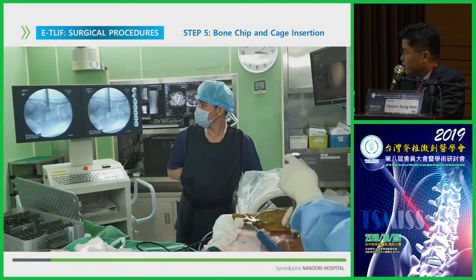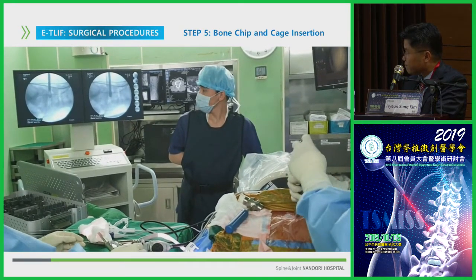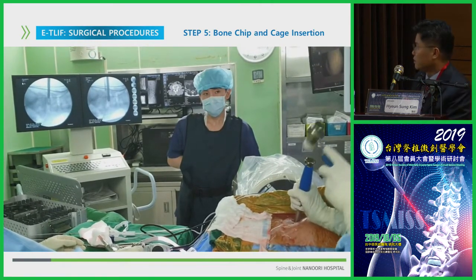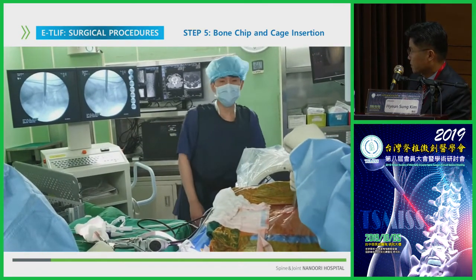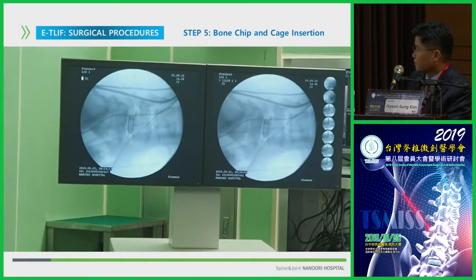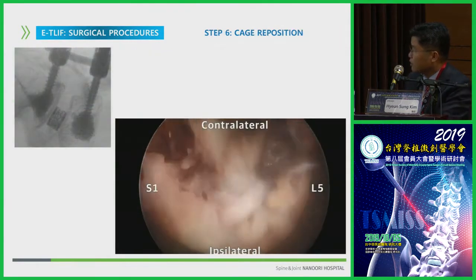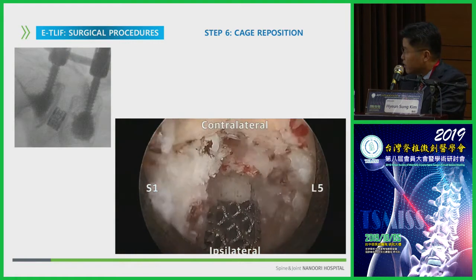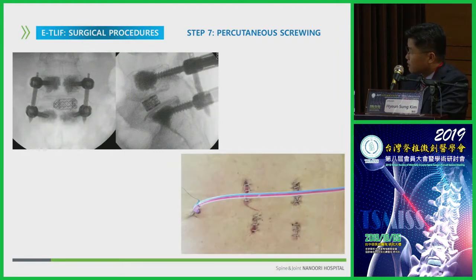Some leverage of the working channel is used because the cage is already inserted into the disc space, and then we change the angle. Insert some more. After that, you check with the working channel endoscope again, and then you can reposition the cage to here. Then you can take an image like this.